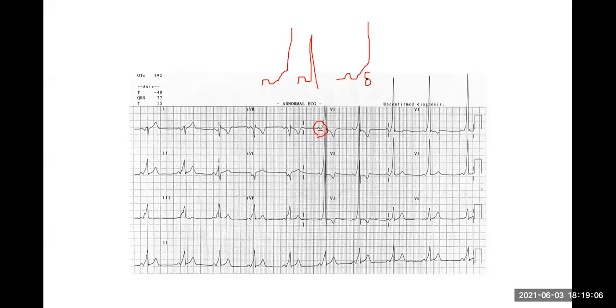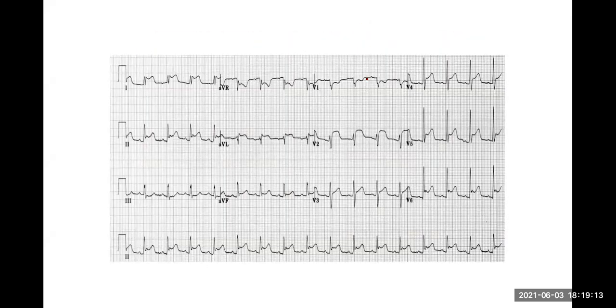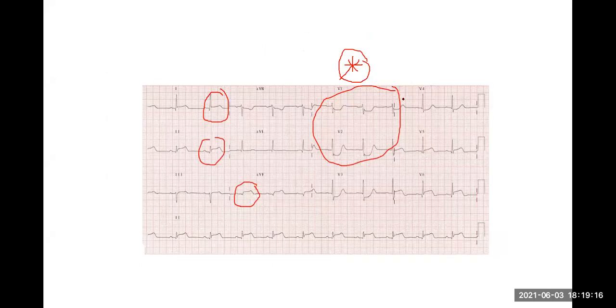Sasanka is asking, is there a way to detect a posterior MI by looking at a standard ECG? I will teach this later, Sasanka, because it's slightly more complicated, but essentially this is a posterior STEMI.